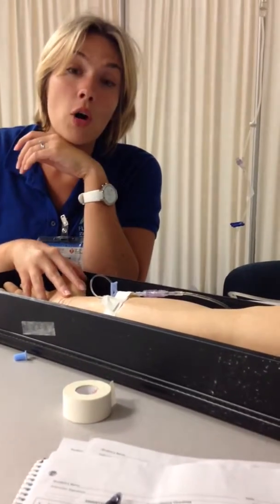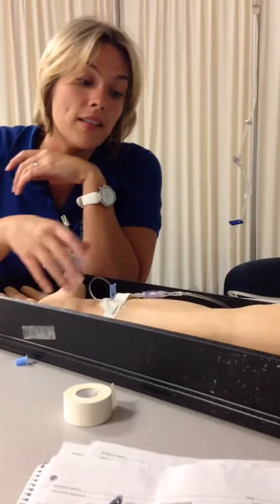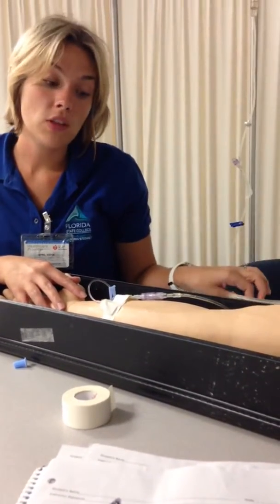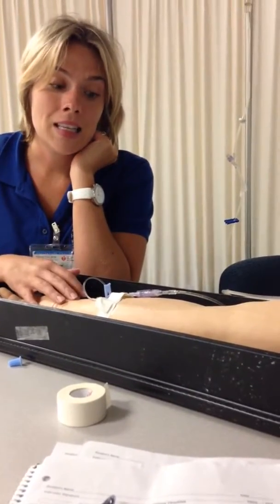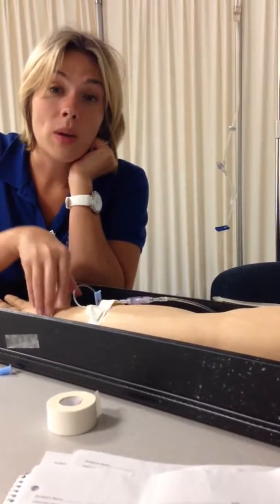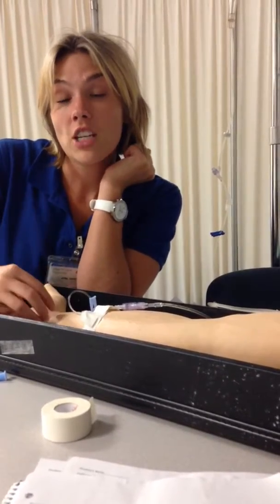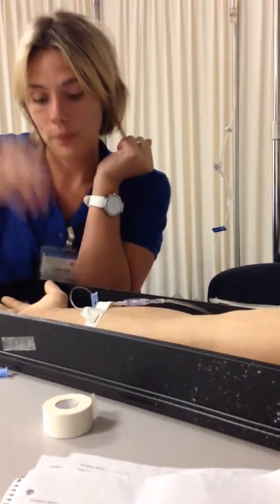I'm educating him on the medication and the reason for the medication. I take a look at the IV. The IV site looks good. There are already fluids going, so I'm going to piggyback that on. Mr. Jones understands. He consents. One thing in the previous part, I'm not sure if it was made clear that whenever I go in a room, I always verify that the patient can respond to their name and date of birth and check their wristband for patient safety, to be sure I have the correct patient.